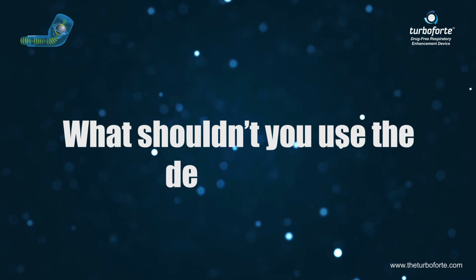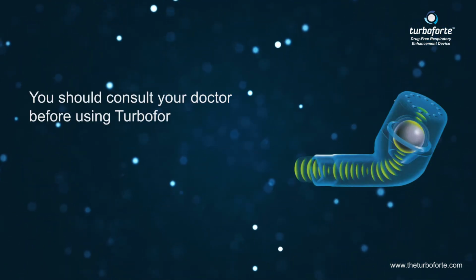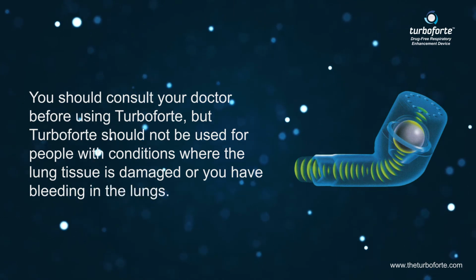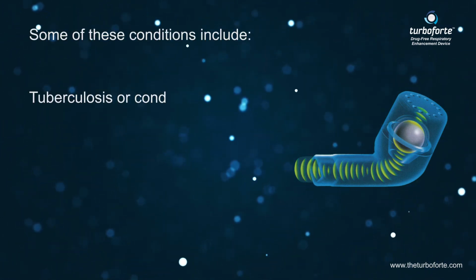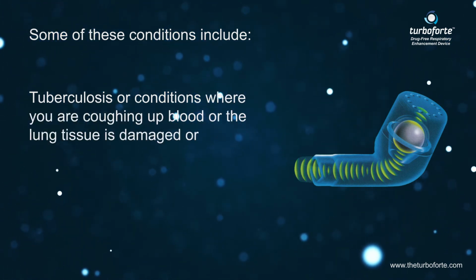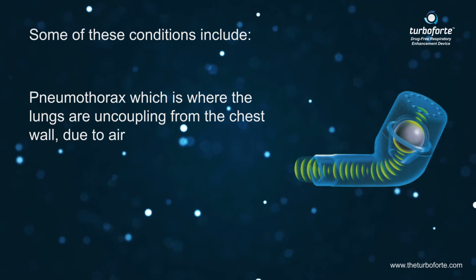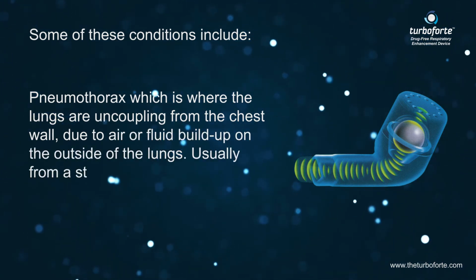What shouldn't you use the device for? You should consult your doctor before using Turboforte, but Turboforte should not be used for people with conditions where the lung tissue is damaged or you have bleeding in the lungs. Some of these conditions include tuberculosis, or conditions where you are coughing up blood or lung tissue is damaged or bleeding. Pneumothorax, which is where the lungs are uncoupling from the chest wall due to air or fluid buildup on the outside of the lungs, usually from a stabbing wound.